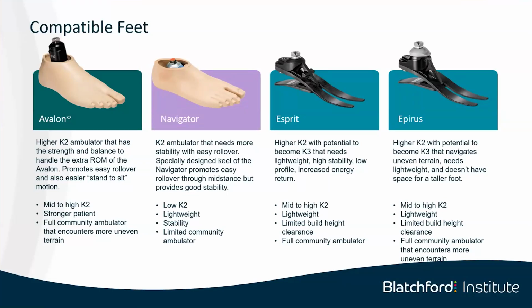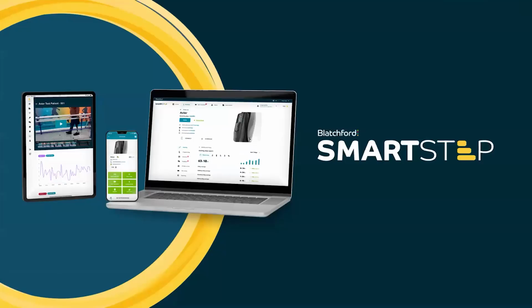The Navigator, for those who don't know it, is the updated version of our traditional Multiflex foot, turned upside down, with the ankle then built into the foot. It gives you a lower build height and double the plantar flexion, which makes it more stable at heel strike. Esprit, the basis of all our K3 feet, is a carbon composite foot with a long toe lever. Then the Epirus, which I use a lot overseas, is again a carbon composite foot, but with a multi-axle joint above it, which we can fine-tune to suit the patient. So it really worked well with transfemorals and bilateral patients by allowing us some fine-tuning of how the carbon springs work.